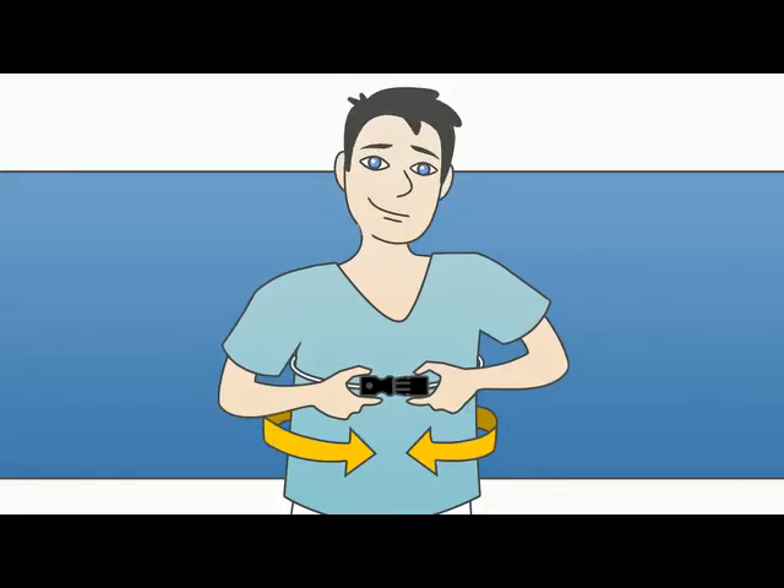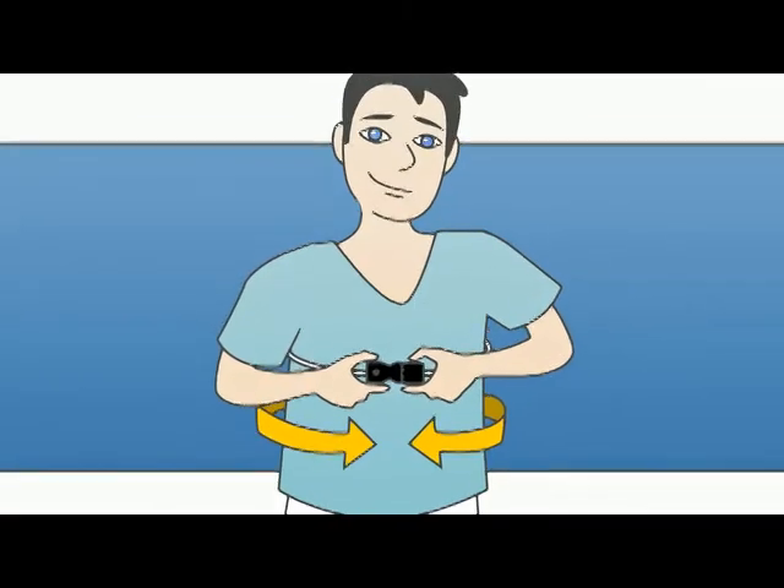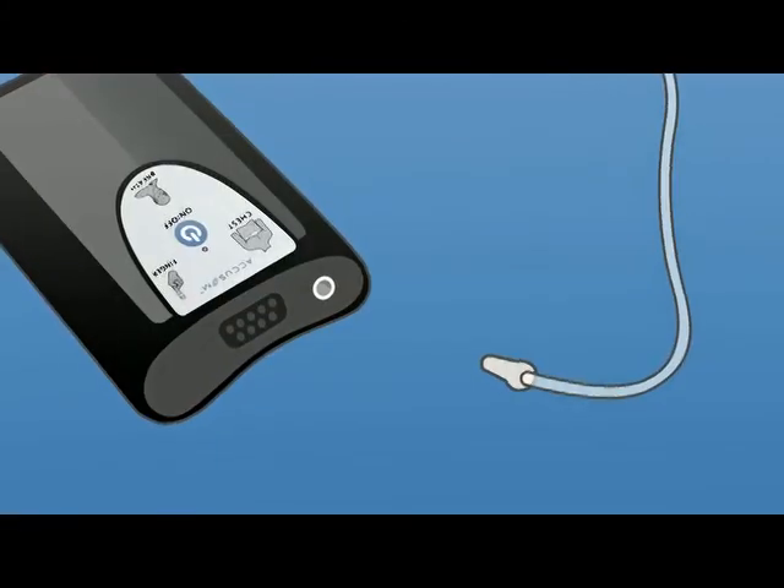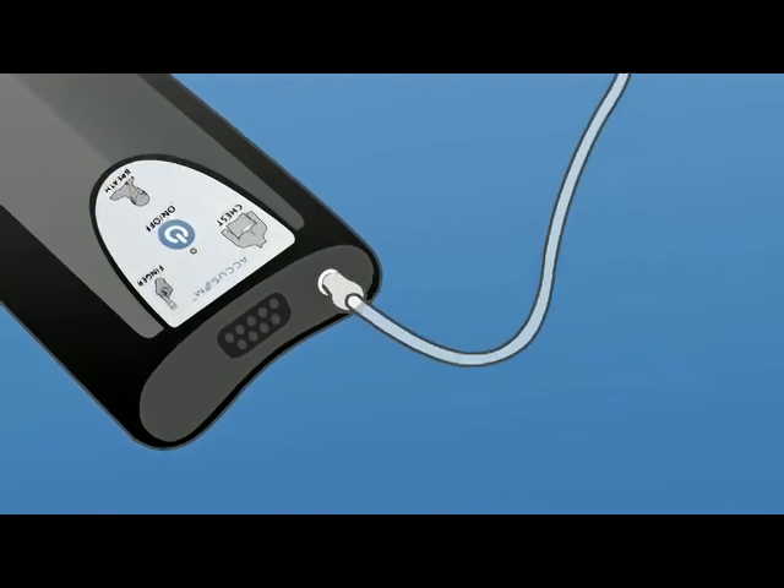First, attach the chest sensor by connecting the black clips around your body. Adjust the belt so it fits snugly under your breasts, then connect the other end to the Accusom.